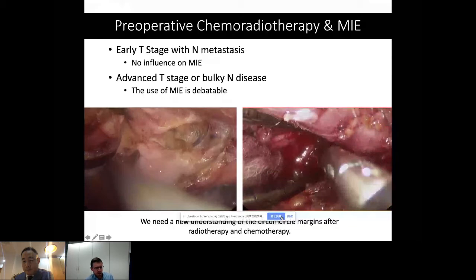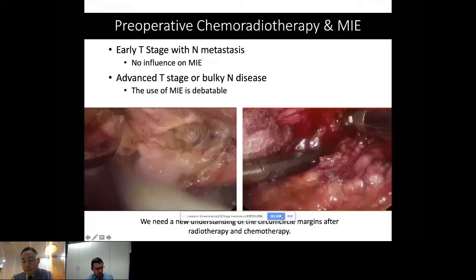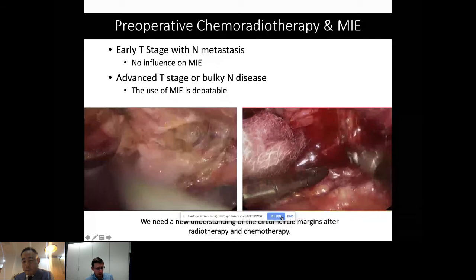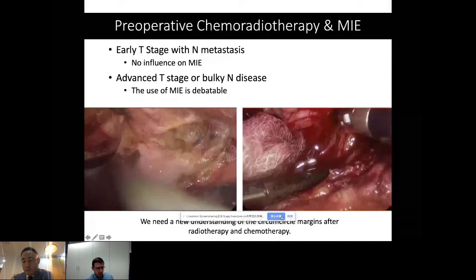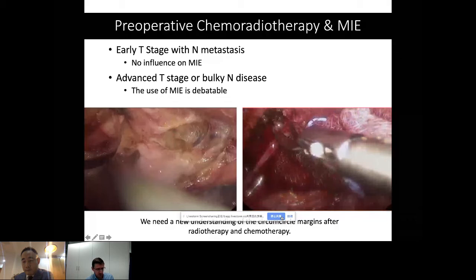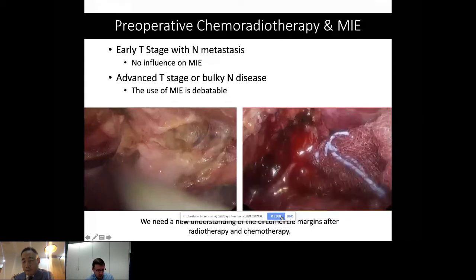Don't you see any problems in the vascularization of the trachea, because the posterior side is completely free, and the lateral left and right also? If you also free up the anterior side through a small sternotomy, then you have a circumference of the trachea that no longer has any blood supply. Do you see any problems in that?